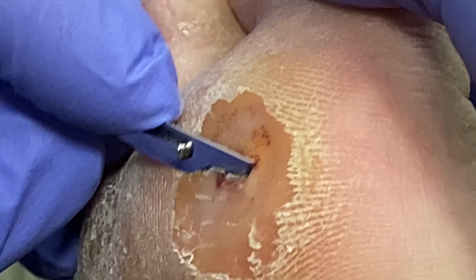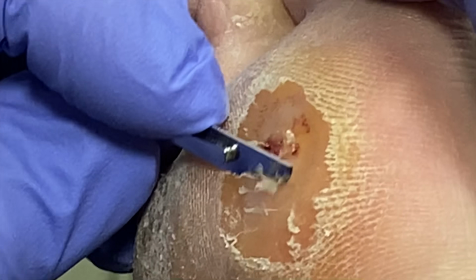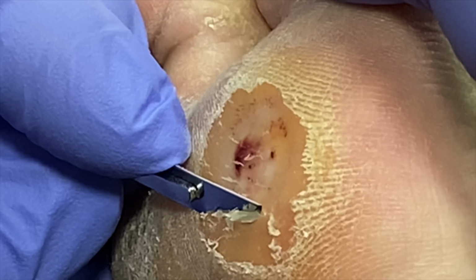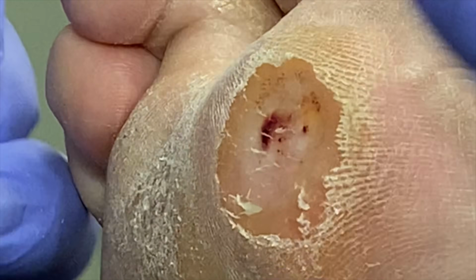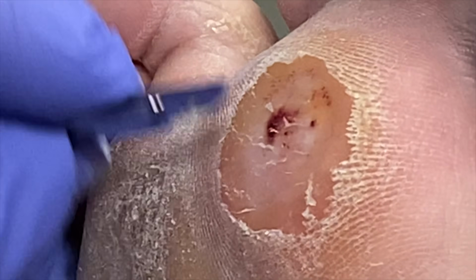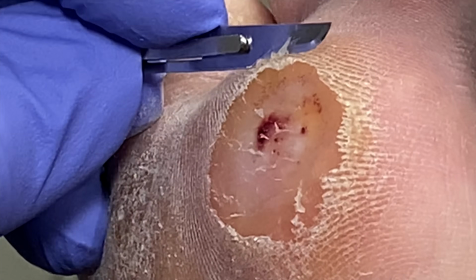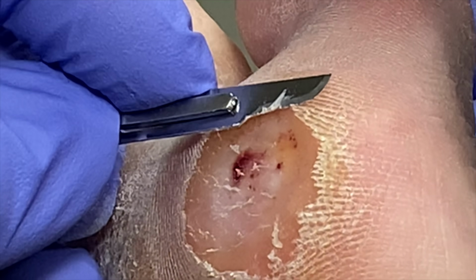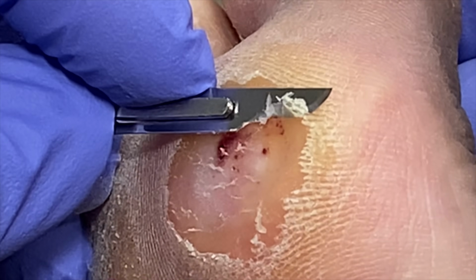So we're down to the level where we want to be. If there was an ulcer, it would be in this particular location. Okay. And I always like to leave a little rim here just because this will protect this since it's so fragile.